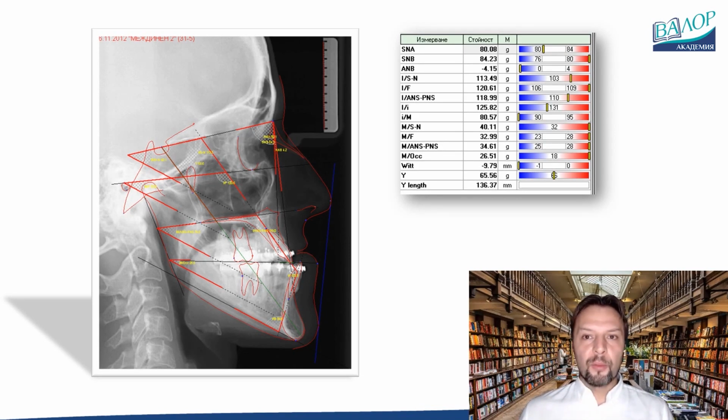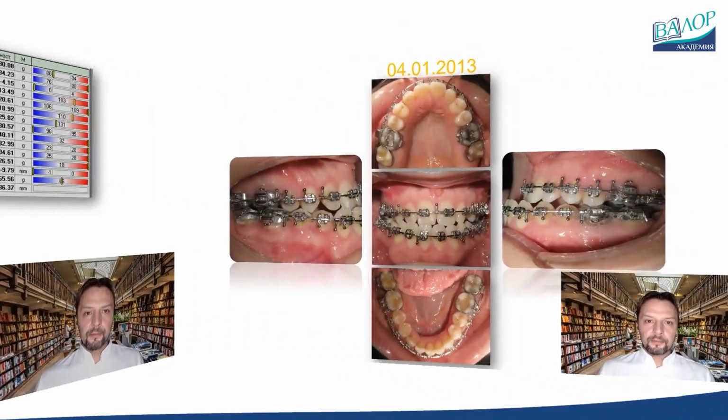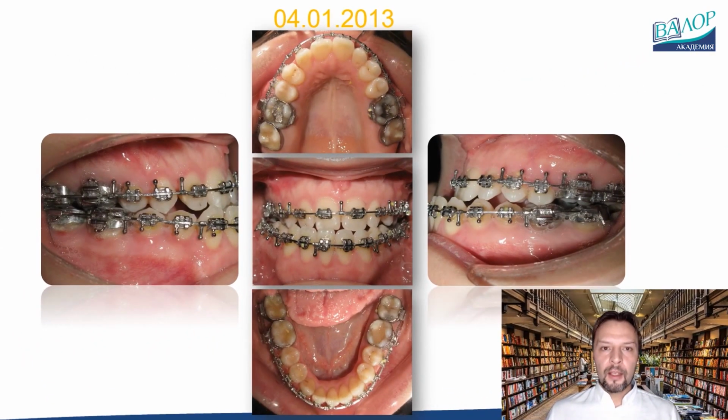The maxillary incisors are proclined for a more prominent upper lip, and the lower ones are greatly improved but not up to 90 degrees due to one lower incisor less. After new control impressions, the next plaster models were cast for inspection just before the operation, for discussion with the surgeon and production of surgical splints.